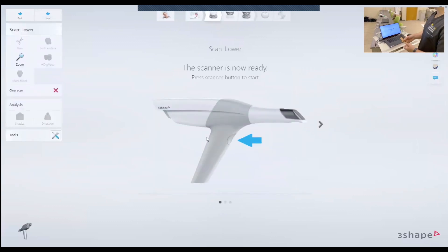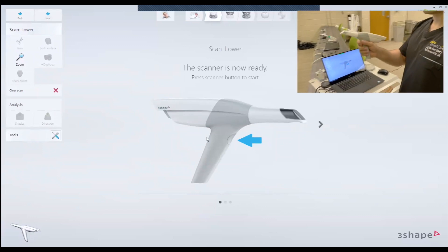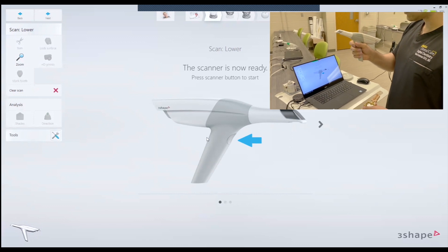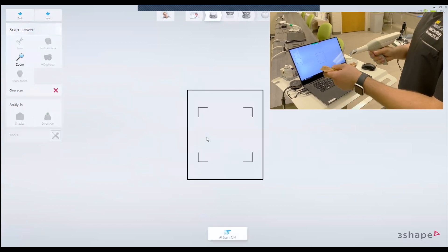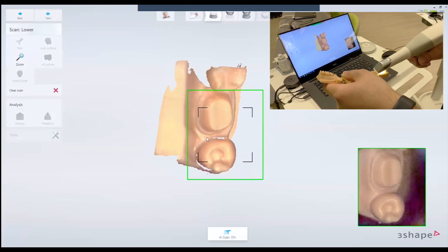Once you have that, you're going to click on the small scanner button here. Now it tells you the scanner is ready. You're going to hold the scanner, and to start the scanner, you're going to press the trigger once.